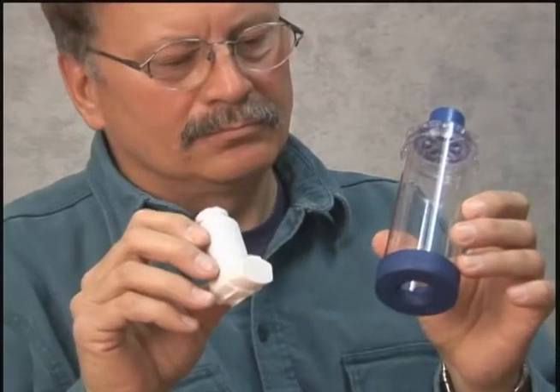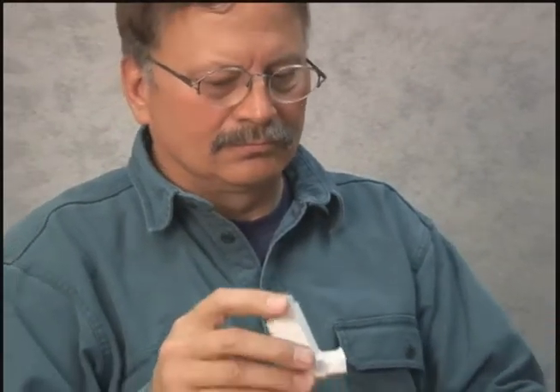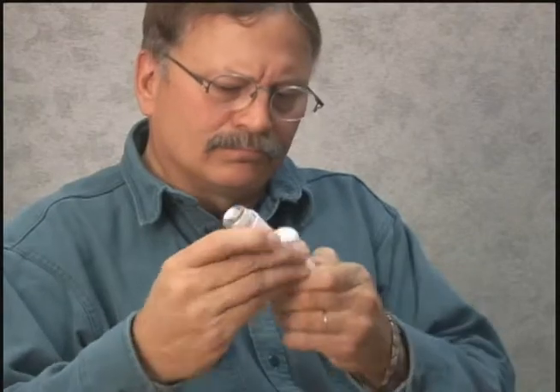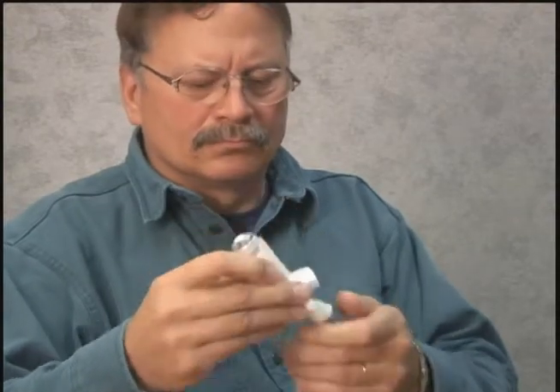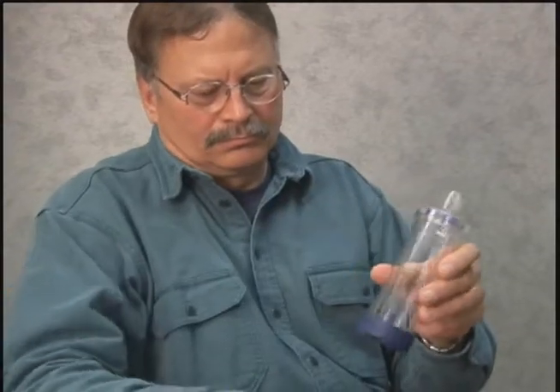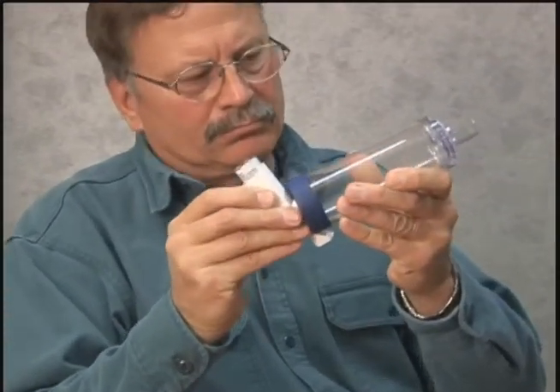Hold the inhaler upright. Begin by shaking the inhaler for at least 10 seconds. Remove the caps from the inhaler and holding chamber. Look inside both ends to make sure there is no damage or object that could be breathed in. Put the inhaler into the end of the holding chamber.